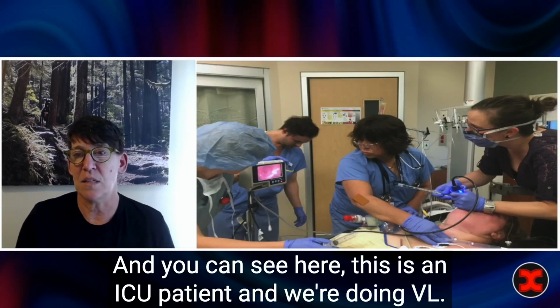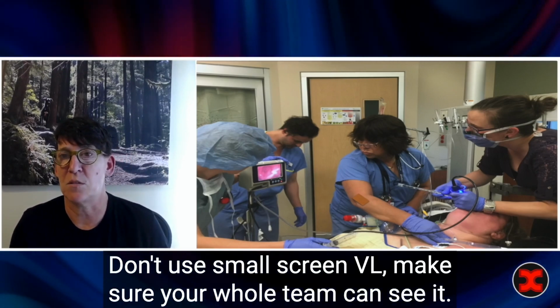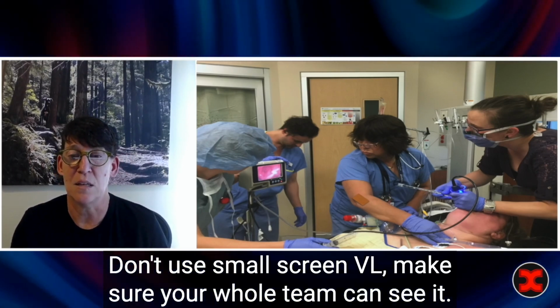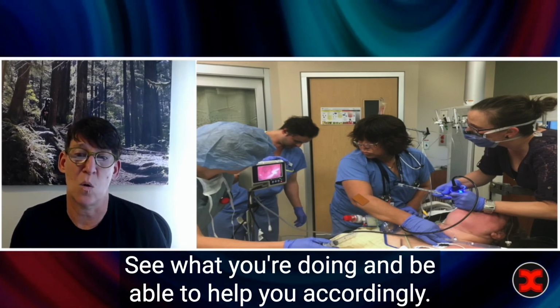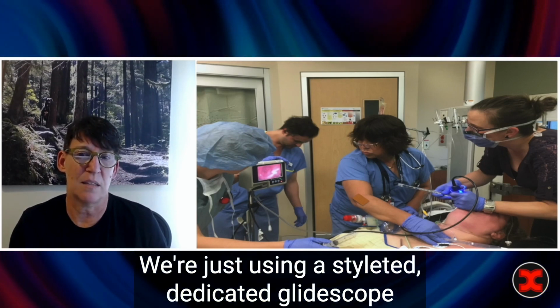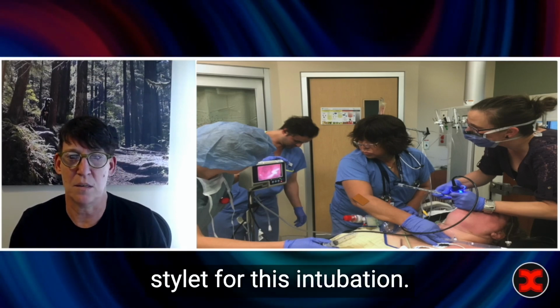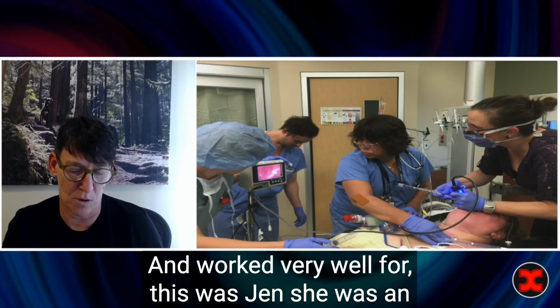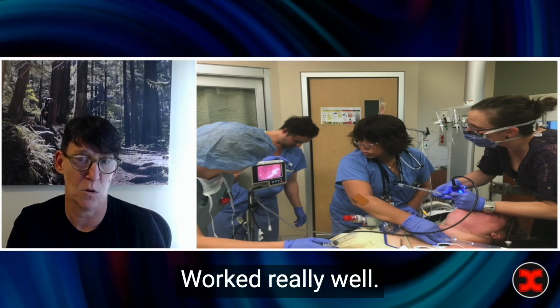And you can see here, this is an ICU patient, and we're doing VL. Don't use small screen VL. Make sure your whole team can see it, see what you're doing, and be able to help you accordingly. And we are not using a combined technique here. We're just using a stylet, a dedicated GlideScope stylet for this intubation, and it worked very well. This was Jen, she was an ICU fellow at the time. This was her first awake intubation, worked really well.